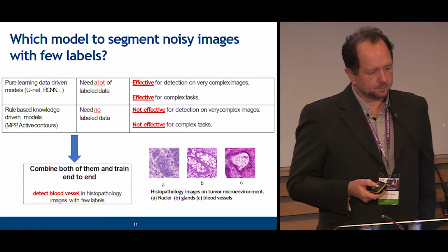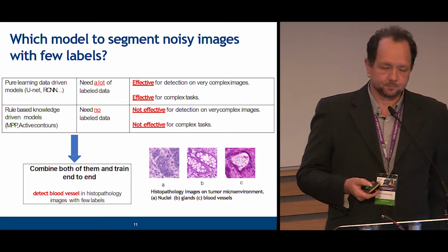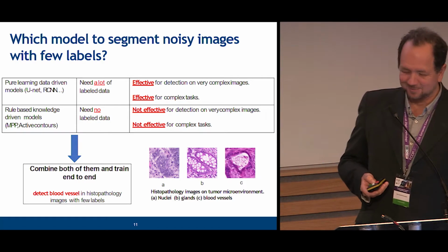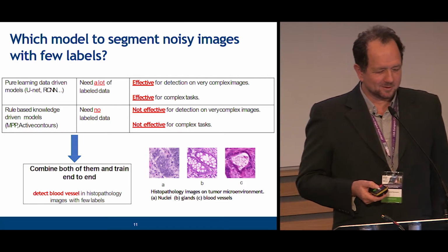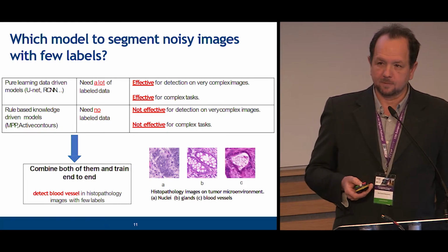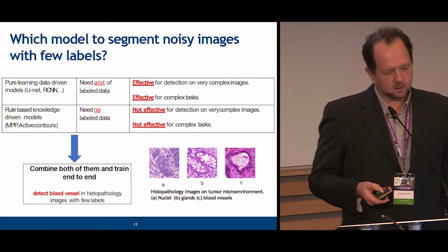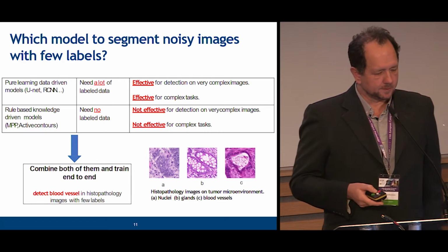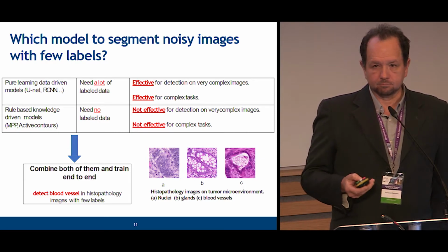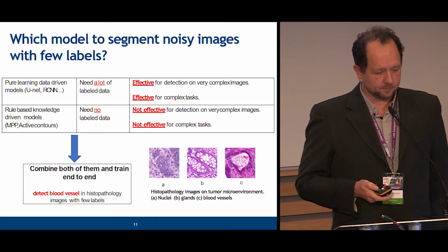So the idea is now that if we would like to use only the deep neural network for that, we will need probably a lot of annotation from you guys. I know this is a tedious work. We all know that this is almost impossible in the quantity we like to have as software engineers. So the idea was to try to find a compromise and to work with different images, like masks, like simulated images, like images created in another way.